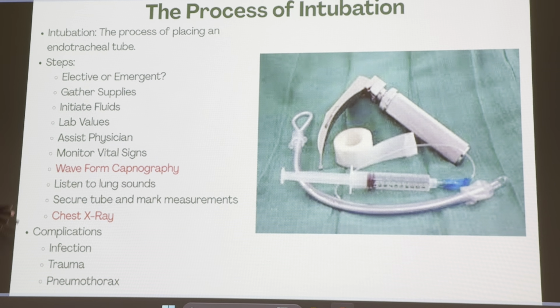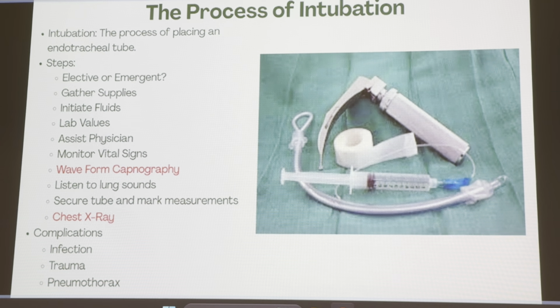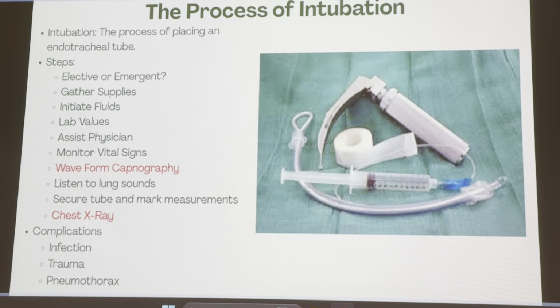Remember, waveform capnography, very important. If I'm not in the right spot, then I'm more than likely in the esophagus or down into the stomach. So as I deliver those breaths, even with the ambu bag or the ventilator, I should not get any CO2. What else would I notice about my patient if I'm delivering air into the esophagus? I hear bloating in the back over there. Bloating, yeah, so their stomach's gonna rise, right?